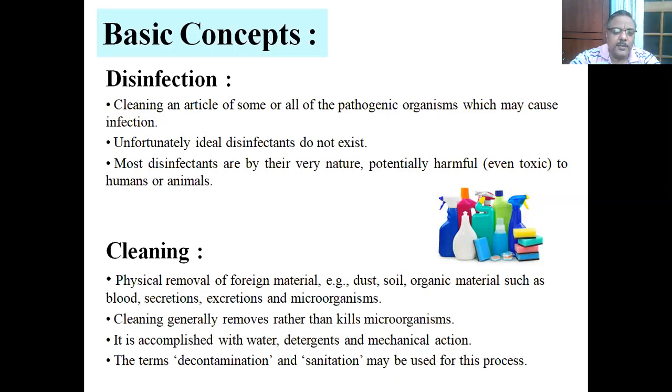The term which we often come across is cleaning. By cleaning, we mean the physical removal of foreign materials, for example, dust, soil, organic material such as blood, secretions, excretions, and microorganisms.